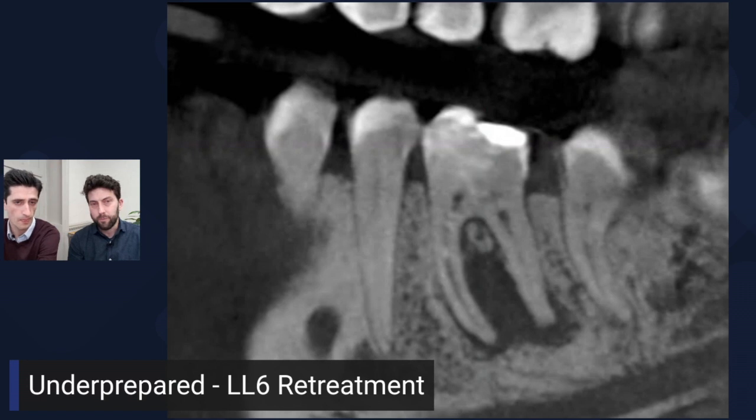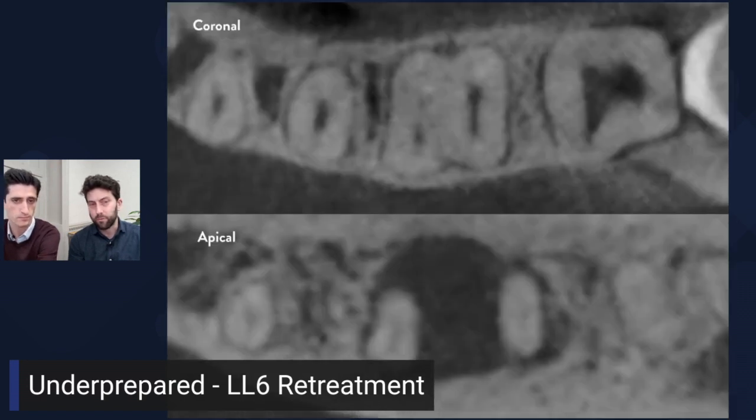Prior to that, we got a cone beam CT scan. The benefit is to assess the accessibility of the root canals. On the coronal slice at the top you can see a narrowish mesiolingual — there's a tiny white speck, just a hint of the paste material — and the distal is a wider, ribbon-shaped canal. On the apical slice, that morphs into one more conical-shaped root canal at the end.